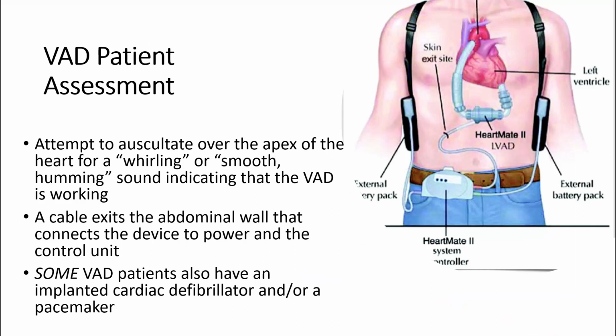So again, you're listening for the whirling or smooth sound. You're also going to inspect where the cable enters or exits the abdominal wall and make sure it's intact, there's no drainage, it's not cut or anything like that. You also notice that many of these patients, I wrote down some, but I actually suspect probably most of them, have an implanted cardiac defibrillator or pacemaker.